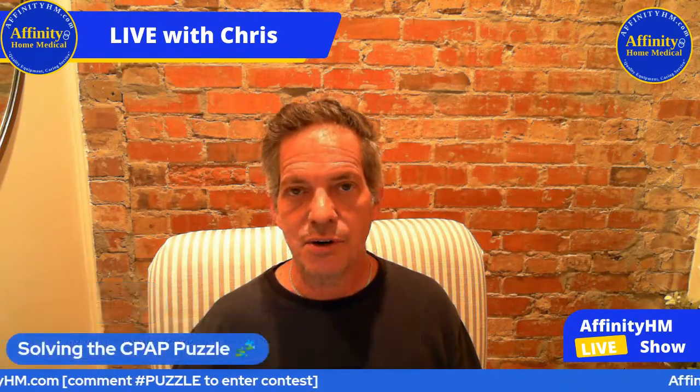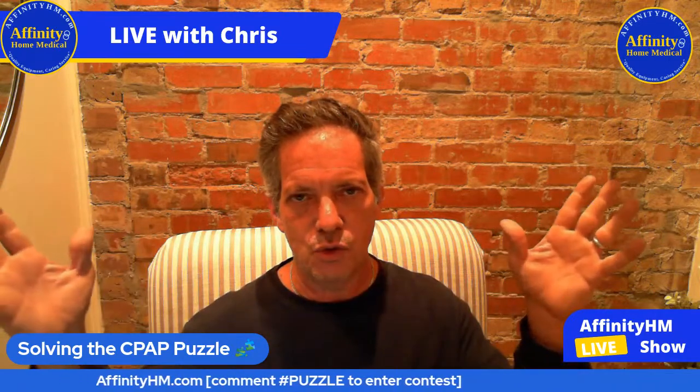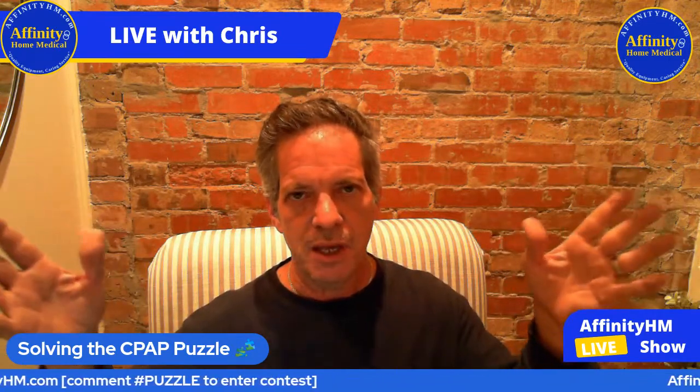Martha is saying, "I have moisture problem with nasal and pillow mask." So, this time of the year, as the weather begins to get cooler, if it's cooler in your house now than it had been during the summer, then you're probably going to have more rain out. Because remember, the rain out, the water droplets inside the tubing, happens due to a difference of temperature inside the tube and outside the tube. So think about the room temperature. If it's colder and the temperature of the machine is the same, you're going to have more rain out.